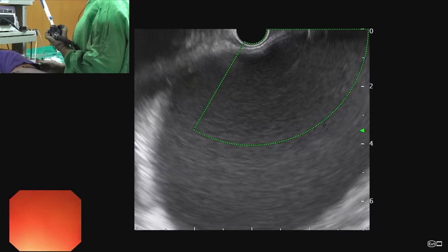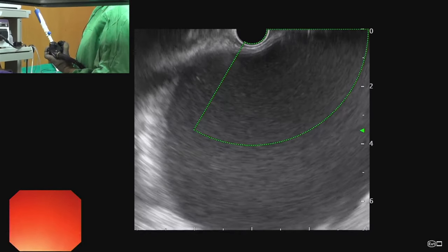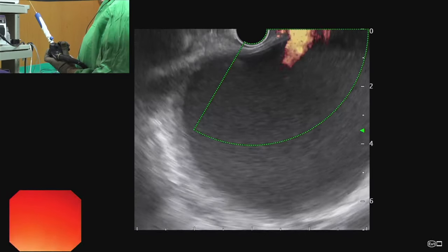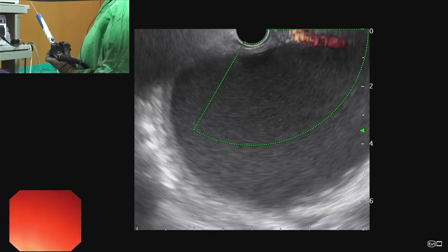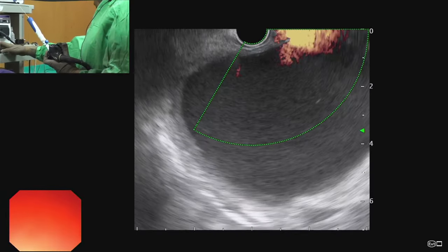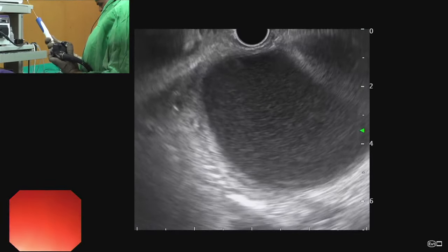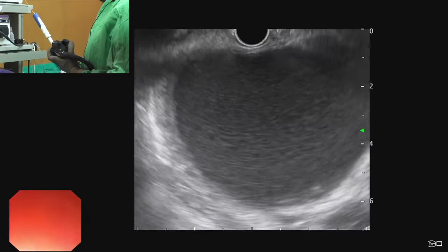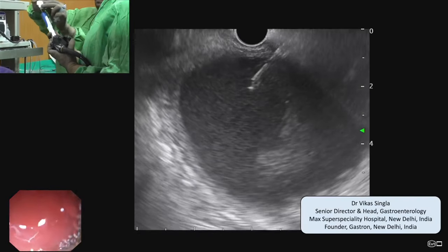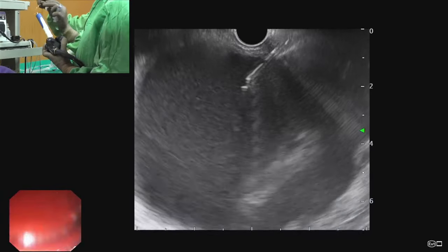Once we puncture the collection with the needle and pass a wire, the scope should be totally fixed toward the gastric wall and the wire should be kept under vision continuously. If the wire is maintained continuously in vision, the further procedure becomes easy. We first puncture the walled-off necrosis with a 19G needle — we can see on the right side that we have punctured the walled-off necrosis with the 19G needle.